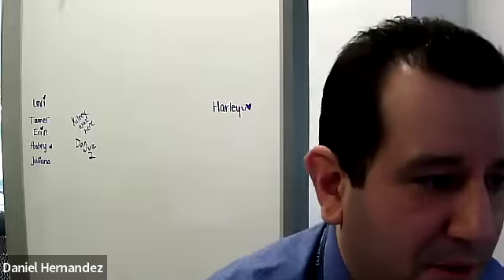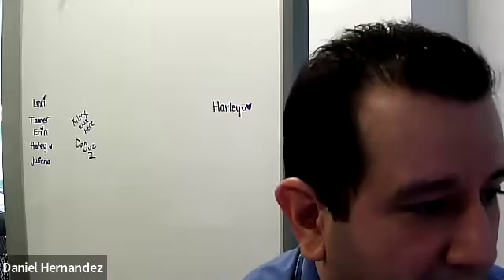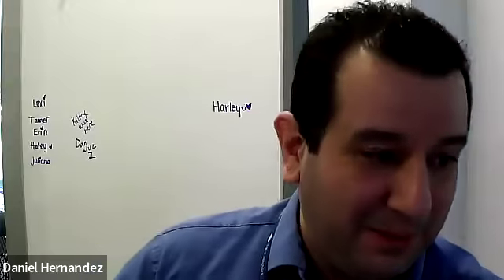It's just showing where McBurney's point is located. So kind of just right above that iliac crest, the bone, the hip bone there. I'll be honest, when I first started scanning appendixes, I was scanning way too high. They're really down in the pelvis. They can be fairly, pretty low.